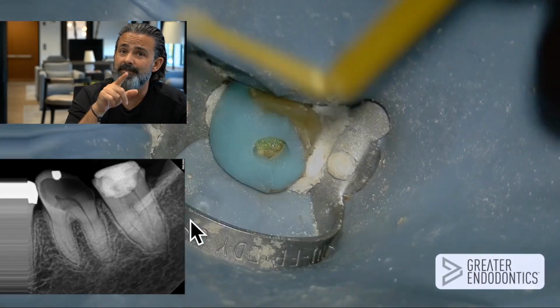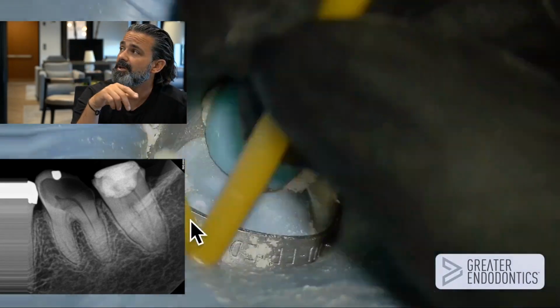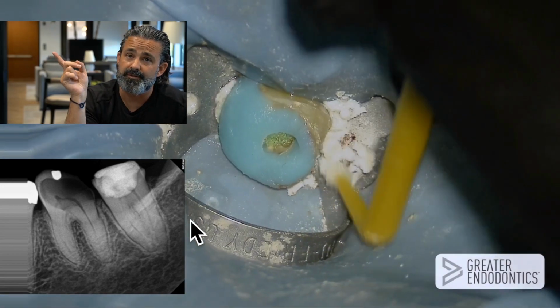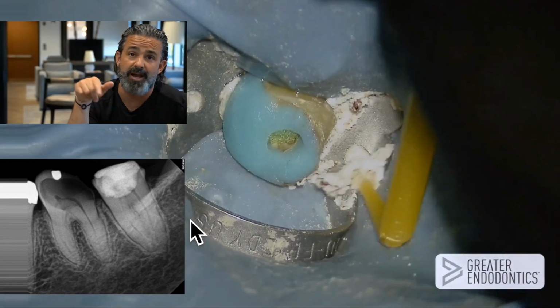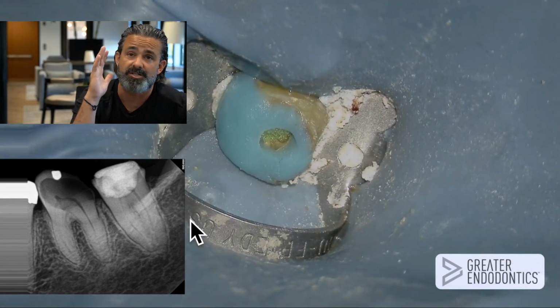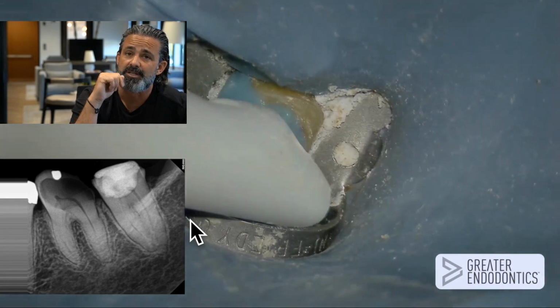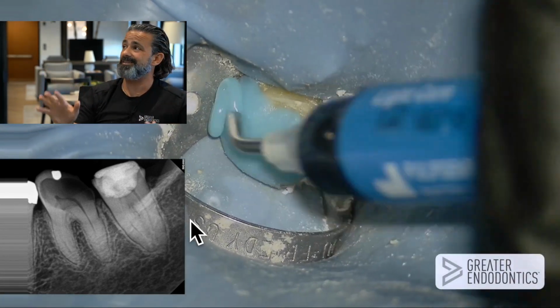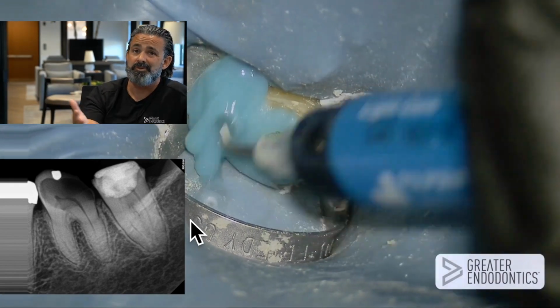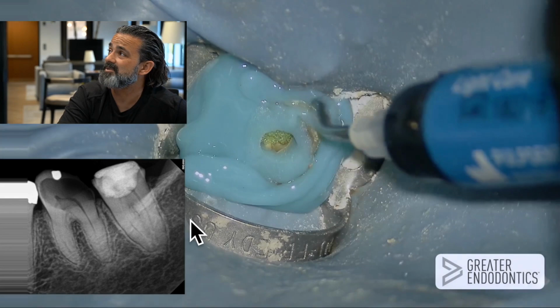So I'm now considering that first sound seal buildup is just tooth. So I put my new breadcrumb in, my sponge, and I'm just taking that bendy brush and drying it all around with alcohol. I just want it dry to get a better stick to this surface now. So now I'm doing the platform build. The first sound seal was not anything to do with a platform other than to rebuild the tooth to give me a nice kind of access, single surface access.